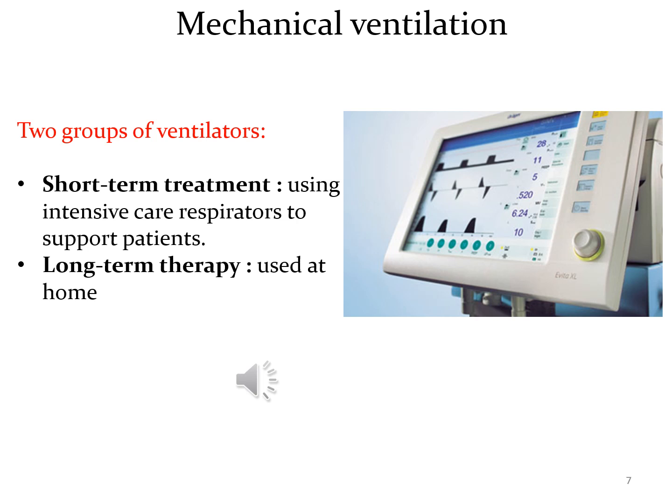Two groups of ventilators exist. Short-term treatment using intensive care respirators to support patients following certain surgical procedures or to assist patients with acute respiratory disorders. And long-term therapy used at home for chronic respiratory disorders.